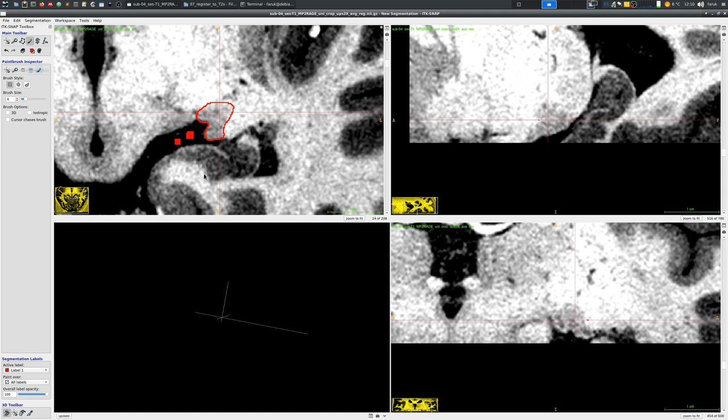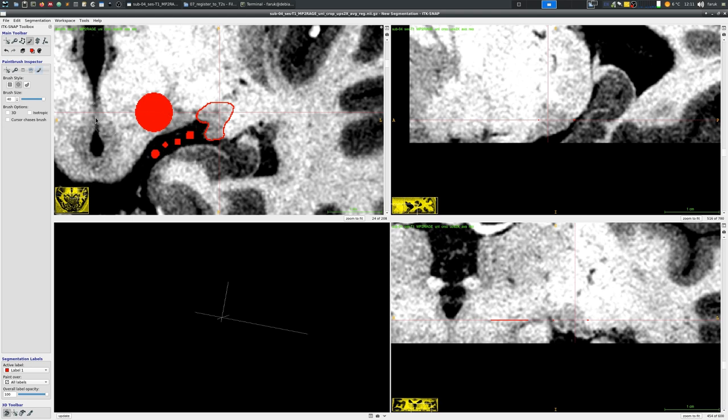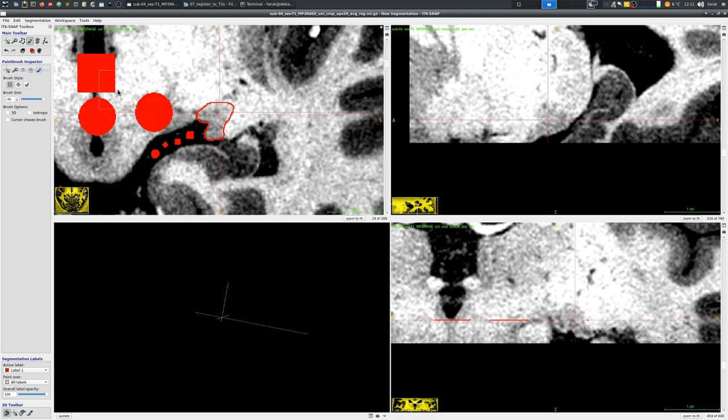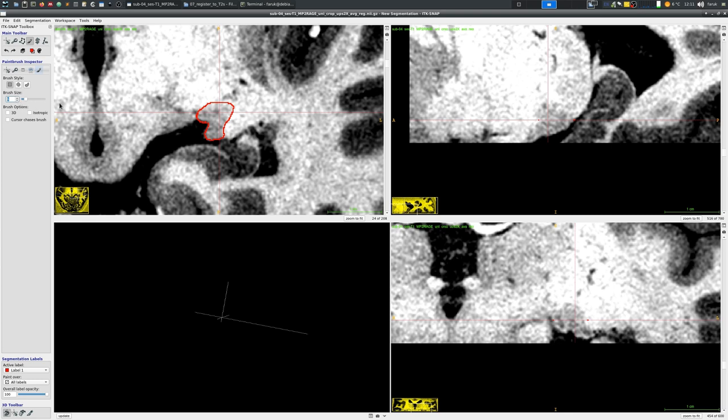Another important point is the brush shape. You can see that now my brush shape is square or a rectangle but I can adjust it to be more circular. You can see the shape button there in the left menu. Of course for segmenting such subcortical structures or many other structures it is more handy to have a circular brush.